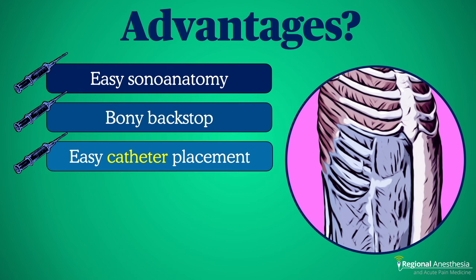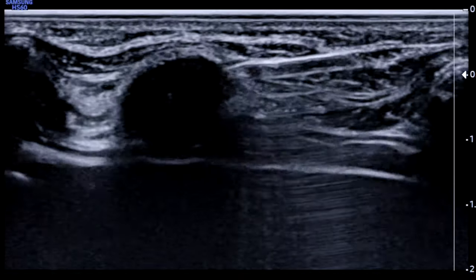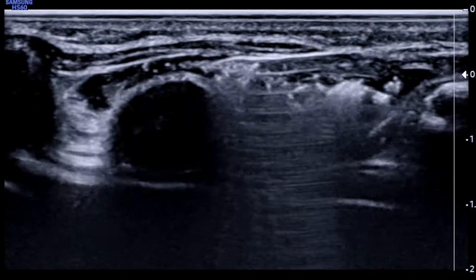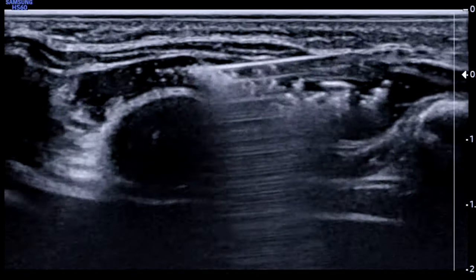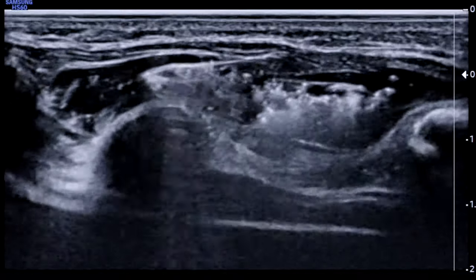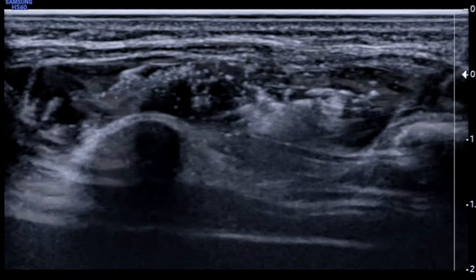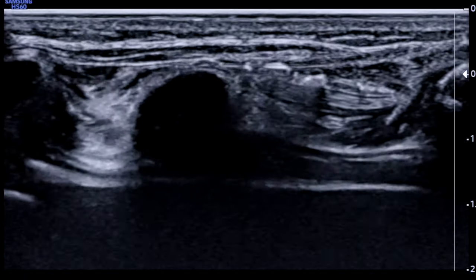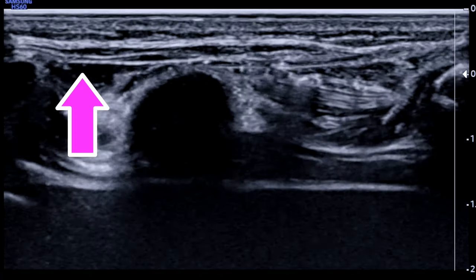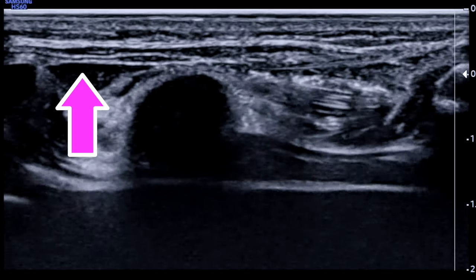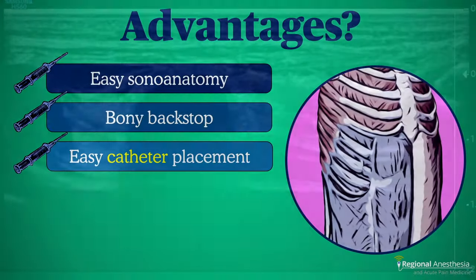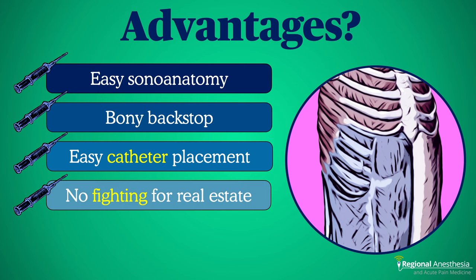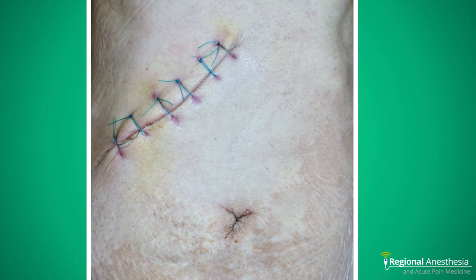Because this is an easily expandable fascia plane, it accommodates a catheter well. Here we see the injection through a Tuohy needle in a three-year-old — nice typical expansion. After the catheter is placed, a small test injection shows fluid expansion in the correct plane. Another advantage over subcostal TAP is you don't have to worry about the presence of an abdominal incision or dressing. Attempting a subcostal TAP with this incision would be virtually impossible given the tissue disruption, and your surgeon might not thank you.